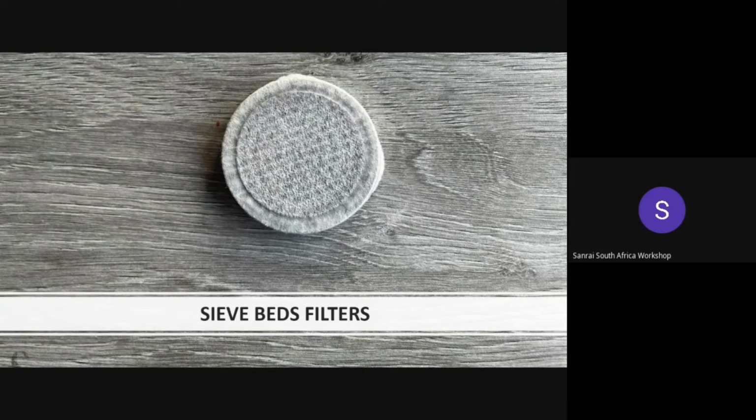If they are dirty, you would need to wash them, if the filters are washable, and let them air dry before use. Replace them if they're damaged to get a good quality oxygen concentration. So for portable concentrator sieve bed filters, like those of Inogen machines, they cannot be washed. So if you have one that is clogged, you would need to replace it.